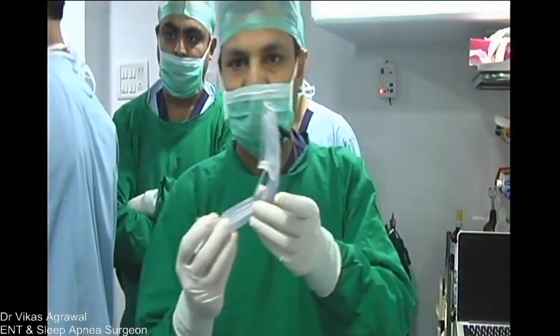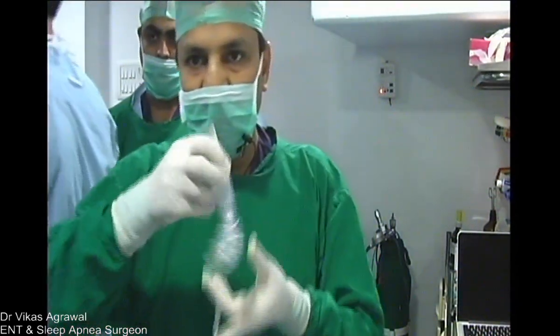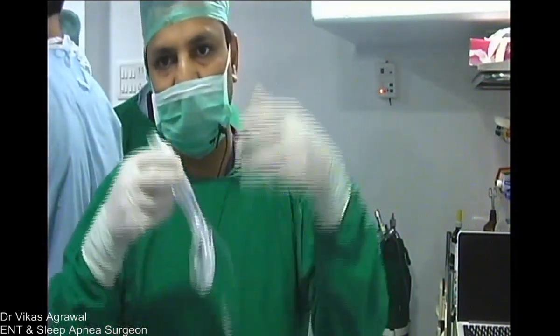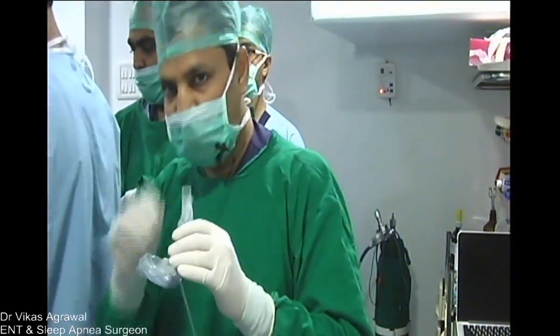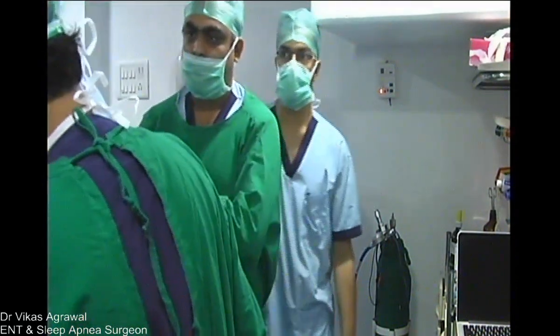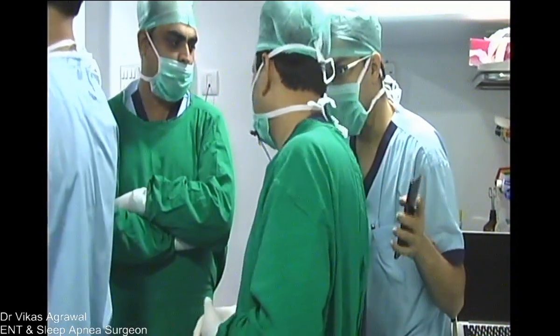And this is the laryngeal mask airway. Okay, so this is the LMA. This will go and fit into the larynx. Even if you put it blindly, the shape is like that, it will go and fit into the larynx. But obviously there are different types of LMAs. Some are intubating LMAs also. You can even intubate through that. So I think Kalpesh and the team will be able to tell you more about the airway management.